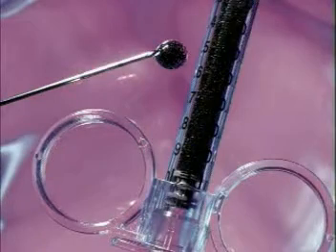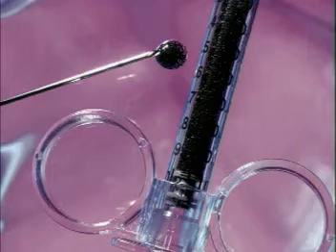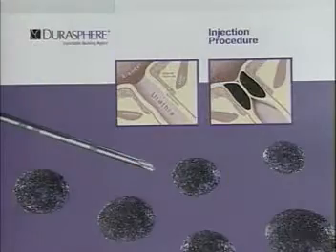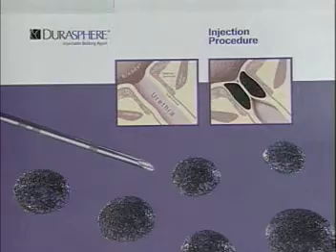Durasphere injectable bulking agent is composed of pyrolytic carbon-coated beads suspended in a water-based carrier gel. Durasphere is indicated for the treatment of adult women with stress urinary incontinence due to intrinsic sphincteric deficiency. This video demonstrates the technique of transurethral Durasphere injection.